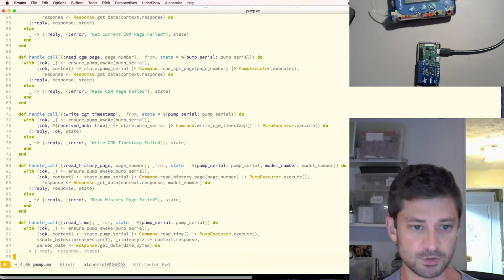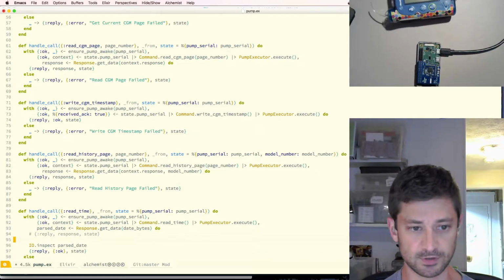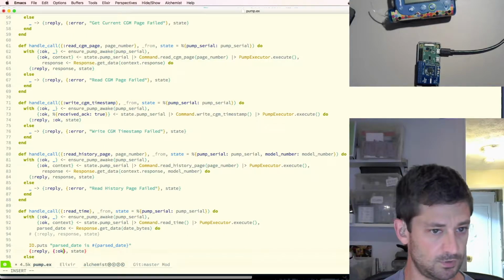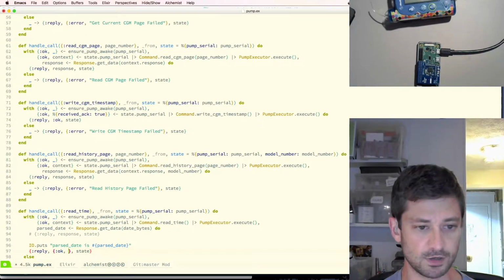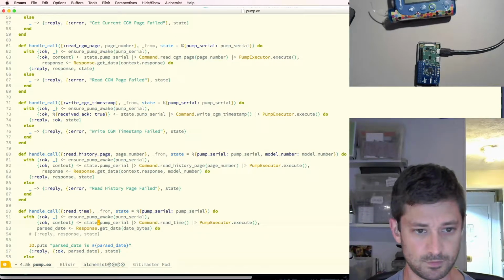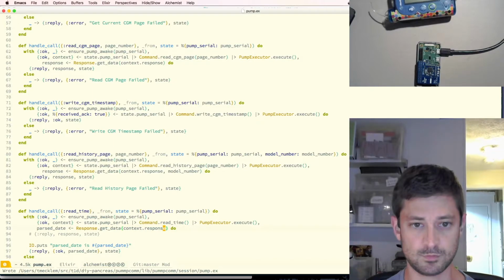So going back into my pump gen server where I was doing this kind of wacky decoding thing, I'm going to stop doing that. That doesn't seem like the right thing. And I feel like I'm getting pretty close here. So I'm going to go ahead and put the parse date in the response. We'll see what happens here.